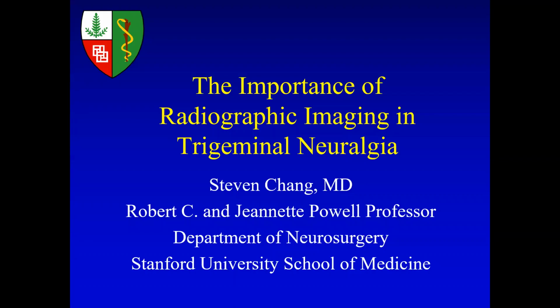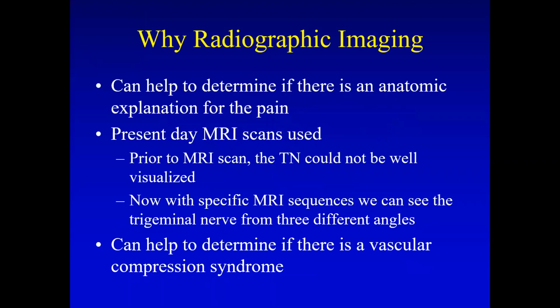Hello. Today I'd like to present a video webinar on the importance of radiographic imaging in trigeminal neuralgia. So why do we emphasize the importance of radiographic imaging, specifically MRI scans, in trigeminal neuralgia? There are several reasons for this.